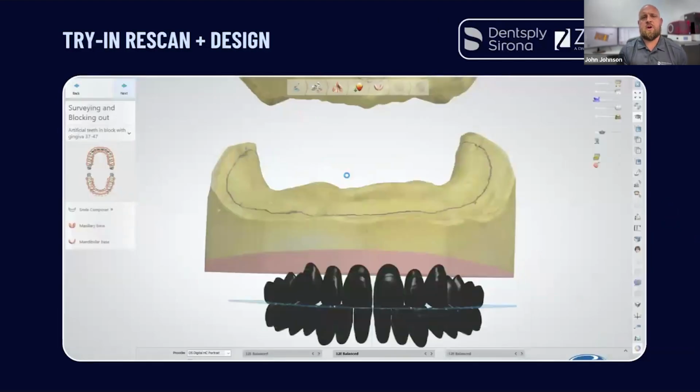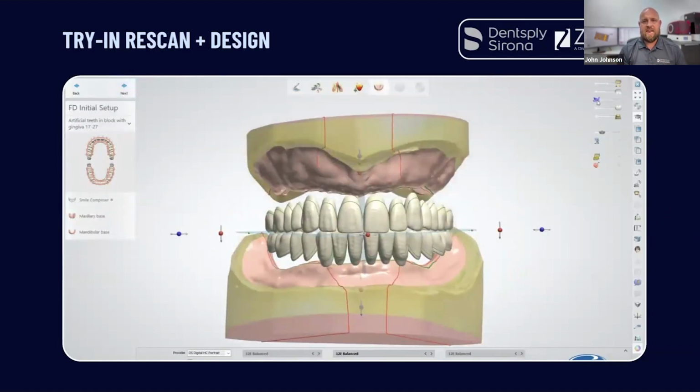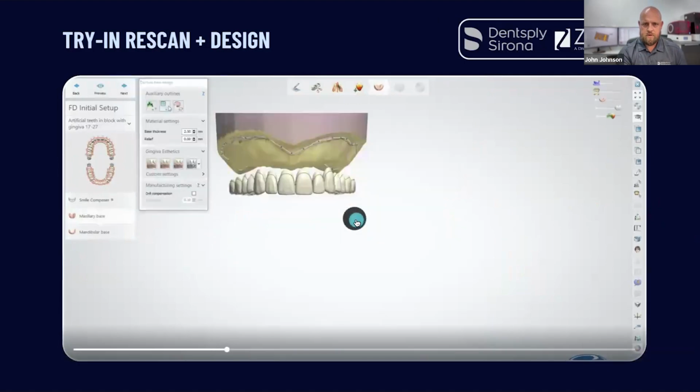This is that try-in. So I'm already at the smile design step, and I've already gone through all the redesign steps. In this particular case, I rescanned. When you go back in from the rescan, it basically replaces your models within your order. In this design, everything has quadrants essentially, and when you move models within those quadrants, that corresponds with where your base was laid out, where your tooth arrangement was laid out.